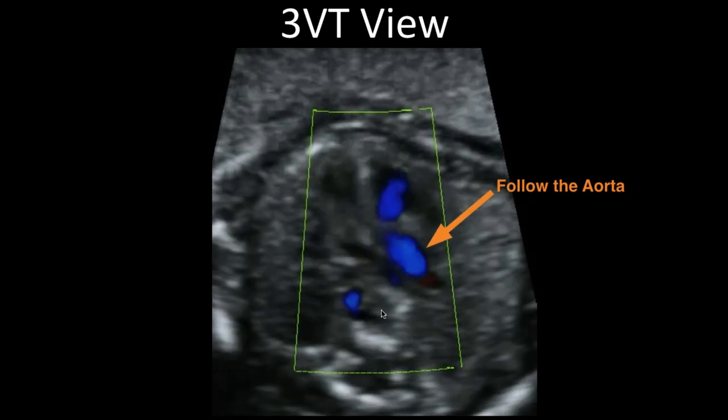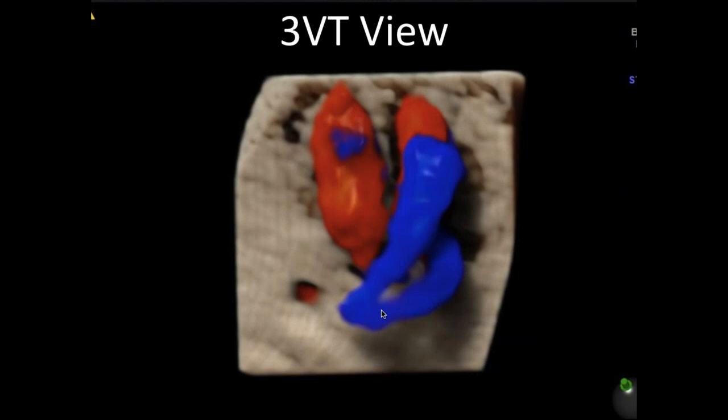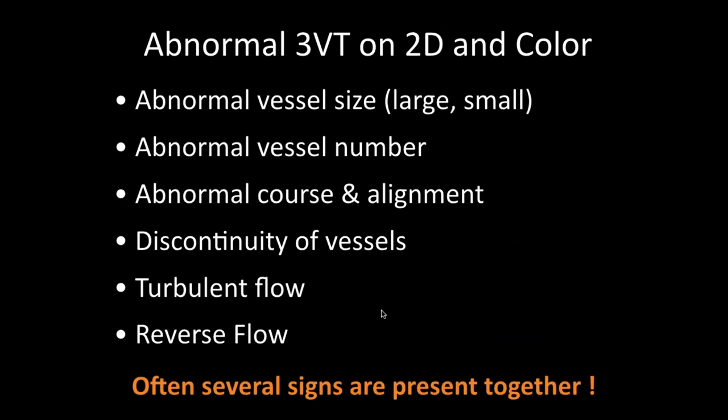Here's a 3D to show the relationship of the great vessels as they come out of the heart. We're going to look at the number of vessels — are they normal or abnormal? If they are abnormal vessel size, is the vessel large or small? Do we have abnormal numbers, abnormal course and alignment? Is one vessel discontinuous? What kind of flow do we have? Many times when you have major anomalies, there are several signs present together.